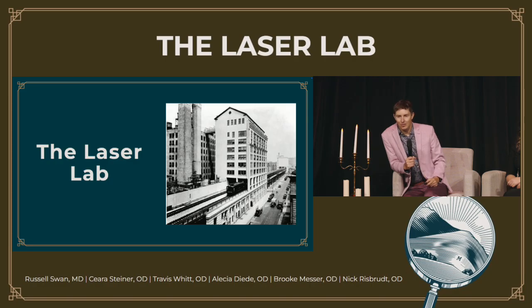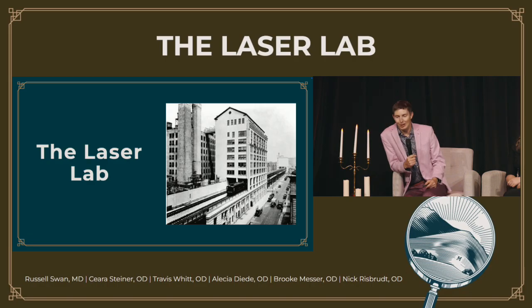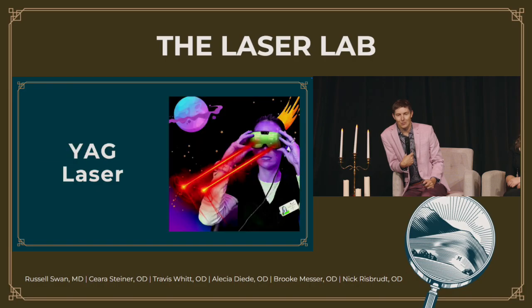Does anyone know what this is a picture of, and or when the YAG laser was first developed? I didn't know, so that's why I put the slide in. This is Bell Labs. So this is where the first YAG laser was actually developed in 1964. Fun fact. So they've been around for a long time. Sometimes patients ask, well, how long has this laser been around? So it has been around for over 60 years, and iterations of it continue to evolve, obviously.